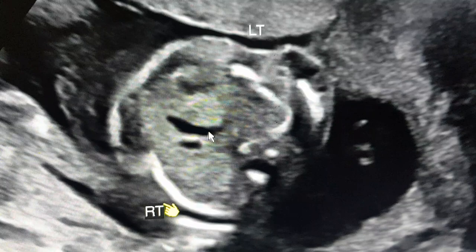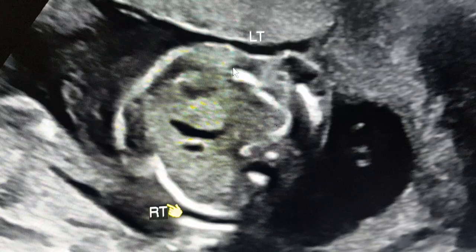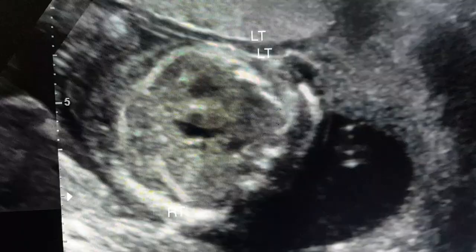Practically I do not know whether this is aorta or pulmonary artery. We just document the presence of two vessels in the three vessel view and I know that we are heading for a major cardiac anomaly.